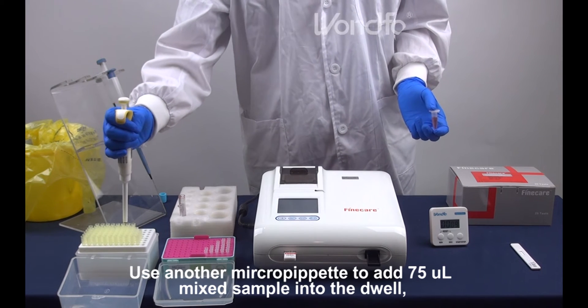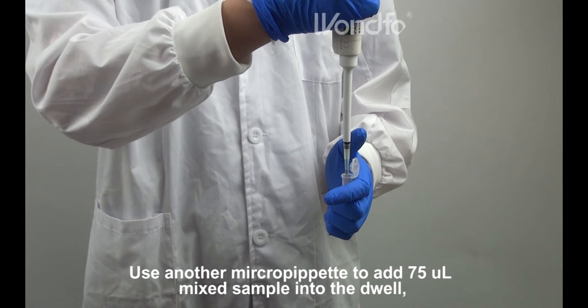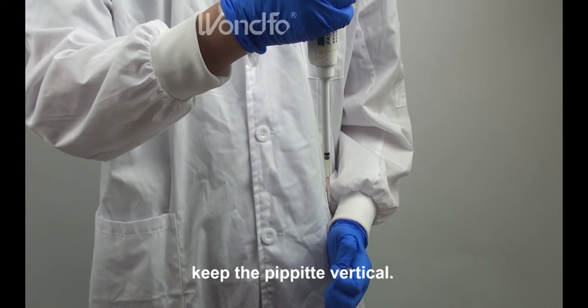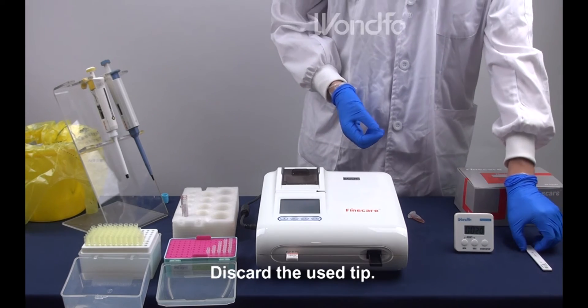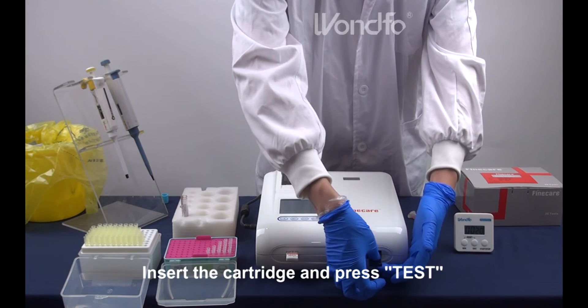Use another micropipette to add 75 µL mixed sample into the well. Keep the pipette vertical. Discard the used tip. Insert the cartridge and press test.